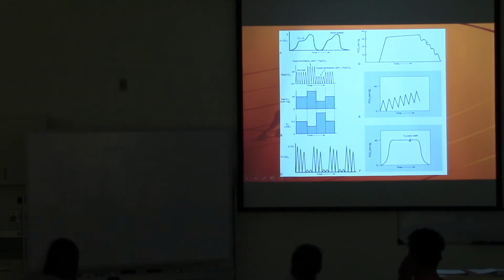This looks like there's air being introduced into the circuit somehow. And that's really all you need to know.